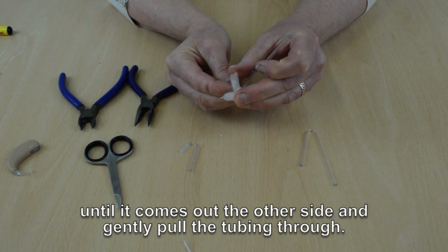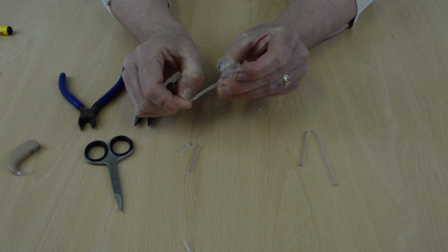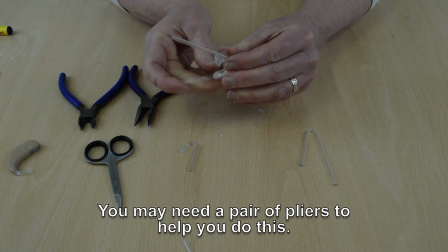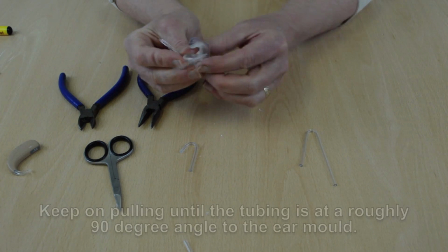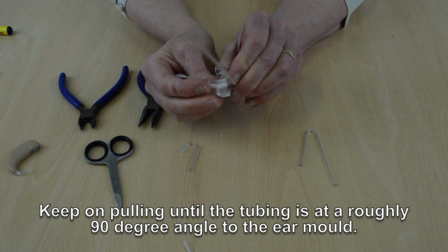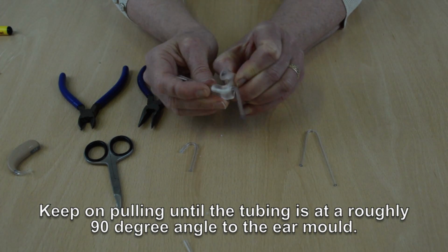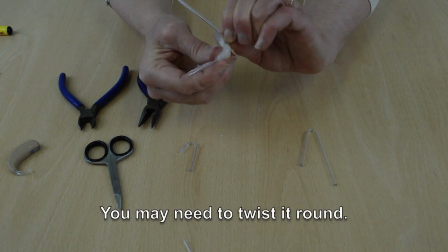Till it comes out the other side, and then you gently pull the tubing through. You may need to use a pair of pliers to help you do this. You keep on pulling through until the tubing is roughly at a 90-degree angle to the ear mould. You may need to twist it round.